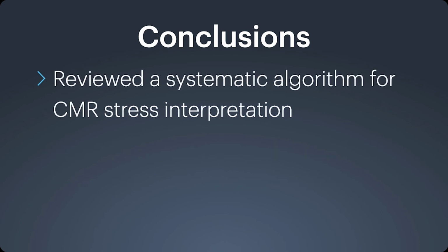And then finally, we reviewed a systematic algorithm for not only performing, but also the interpretation of cardiac stress MRI.